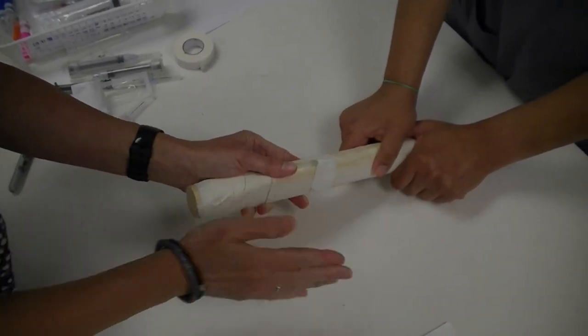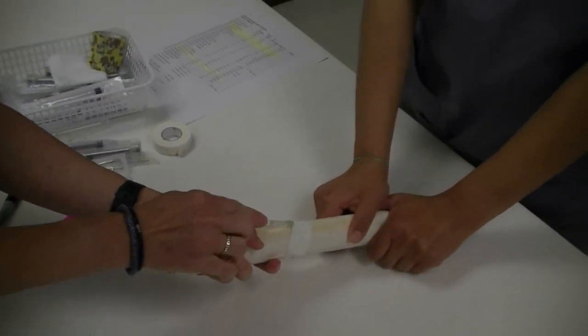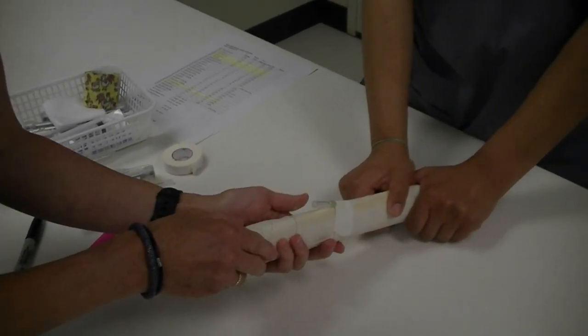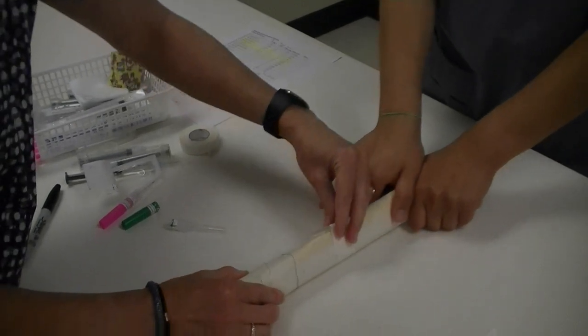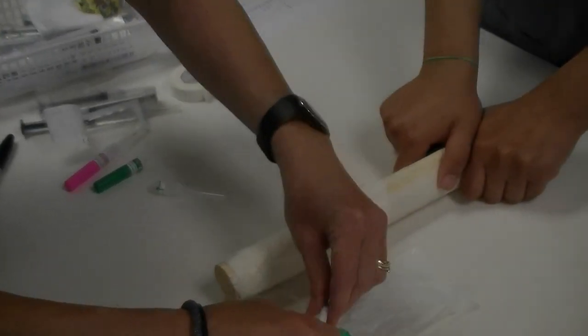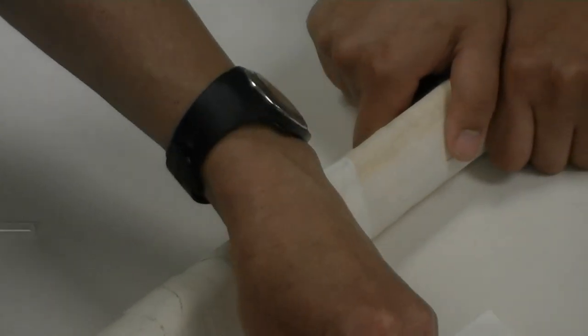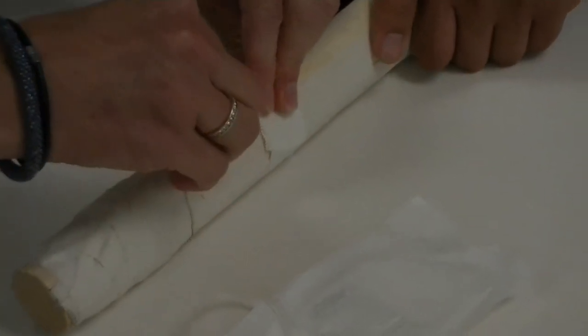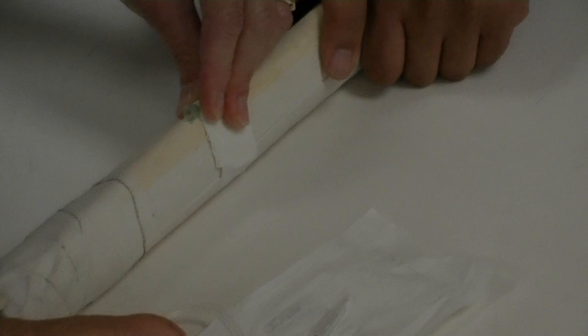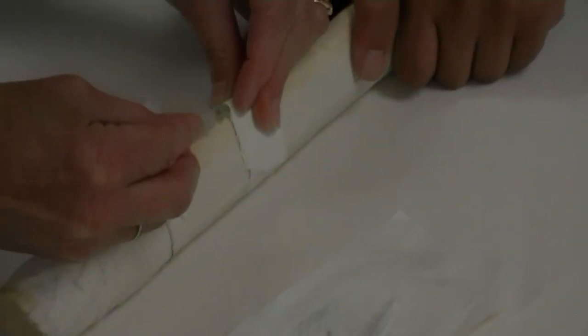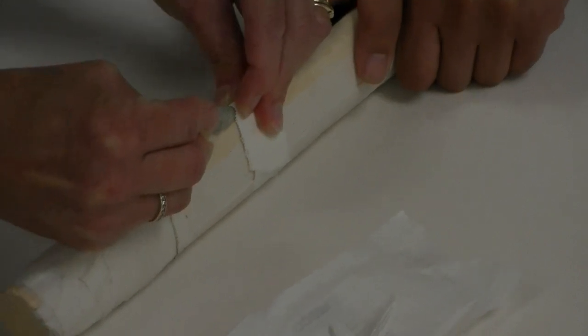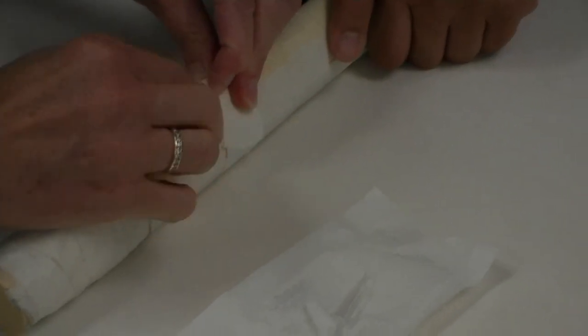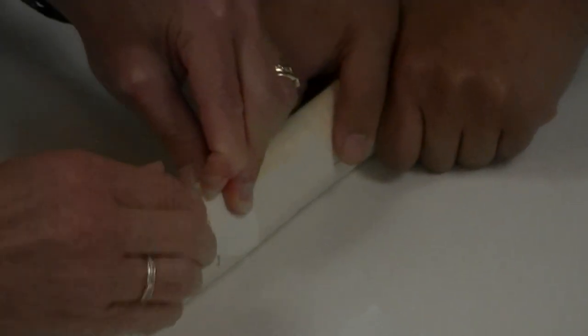Now it's secure enough for me to remove this temporary cap and apply my T-port set, my injection ports. I'll lower that limb a little bit and have this ready to go with the cap loosened, making sure that stays capped and sterile. Then I can remove this temporary cap and place the T-port adapter onto there. In this case, this brand has a luer twist, so I'm going to twist that into place and secure it there.